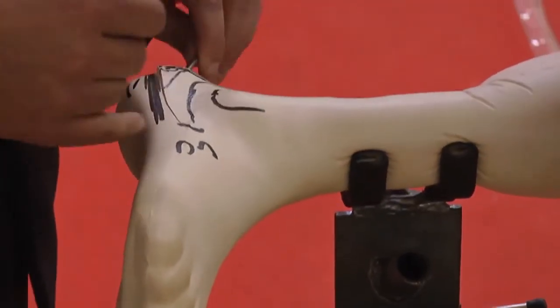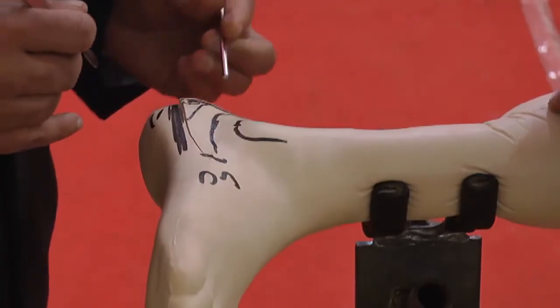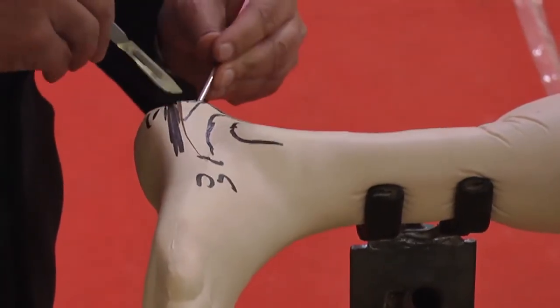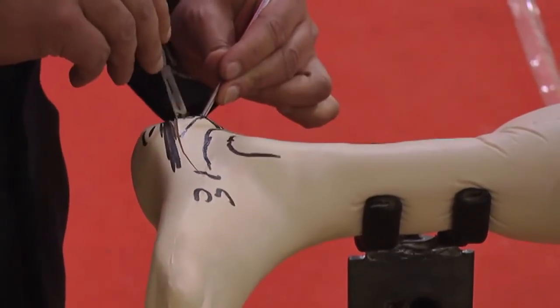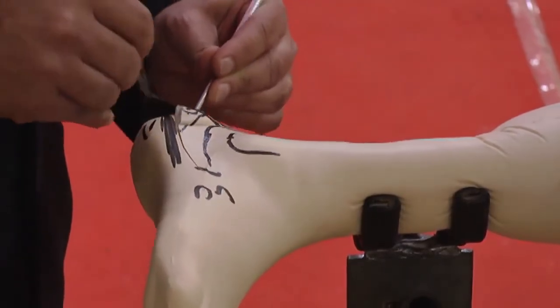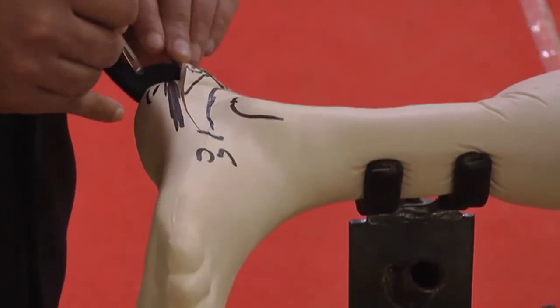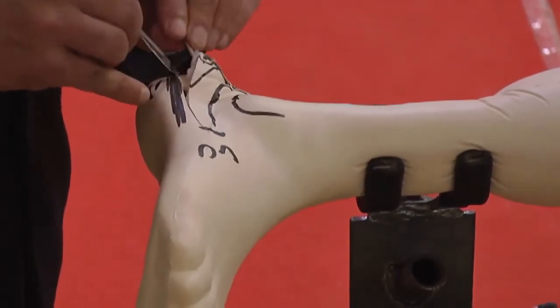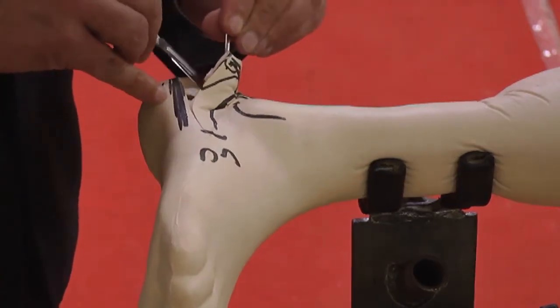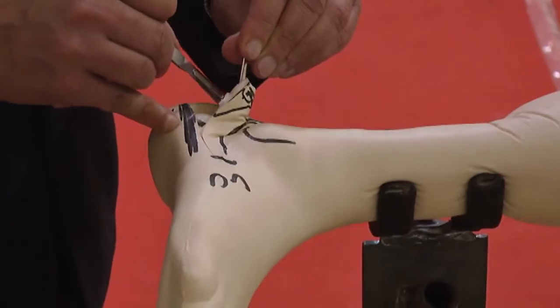In an actual situation, I'll use the back of my forceps and not hold the tip of the flap. You start your dissection at the level of the curve and then go deep onto the bone, and just lift off this flap from the bone with your forceps. As you lift your forceps up, there is an area of junction you will see between the flap and the bone.